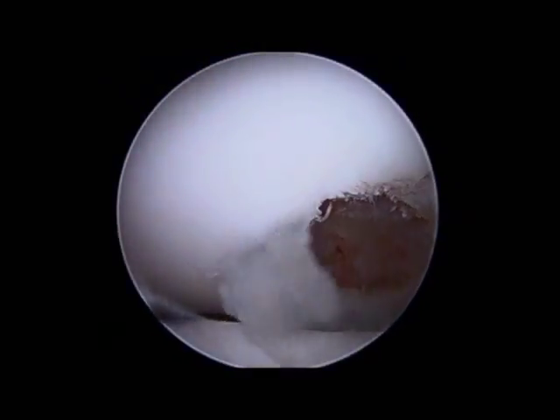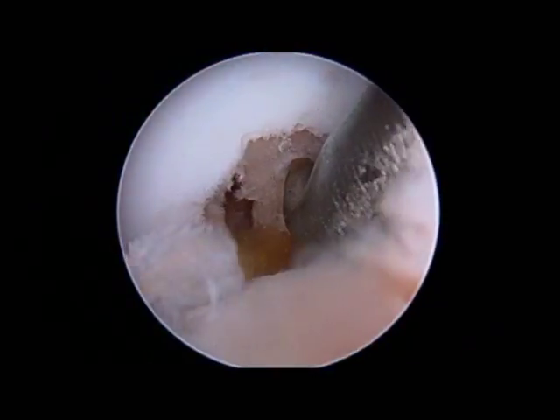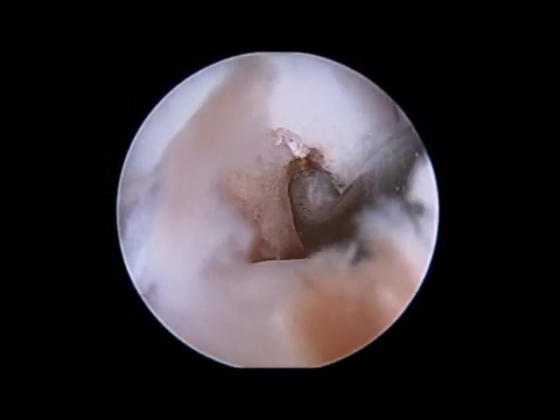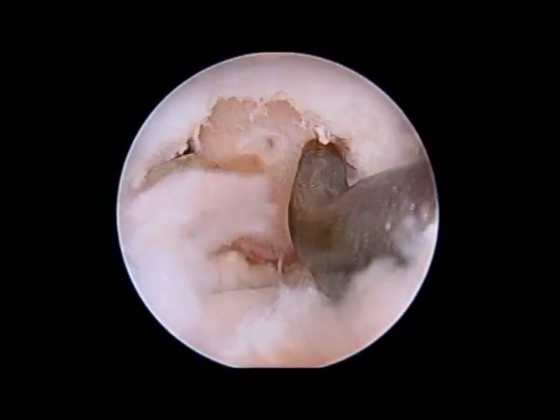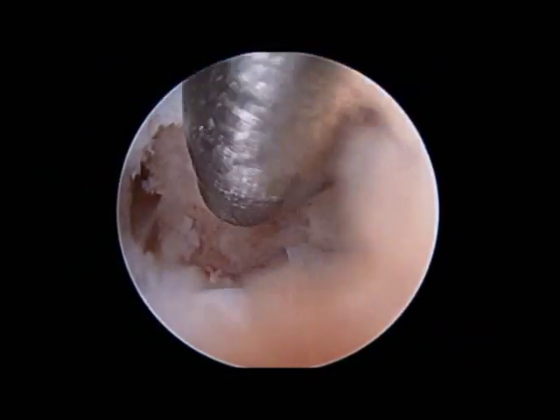This is addressed with something called microfracture. You can see that being done here, where a metal pick is brought into the joint to punch small holes into the bone at the base of the lesion. These holes are vascular channels that allow the inflow of blood and bone marrow stem cells to regenerate new cartilage to resurface and cover this bare bone.